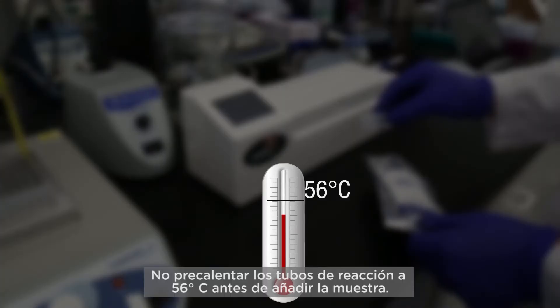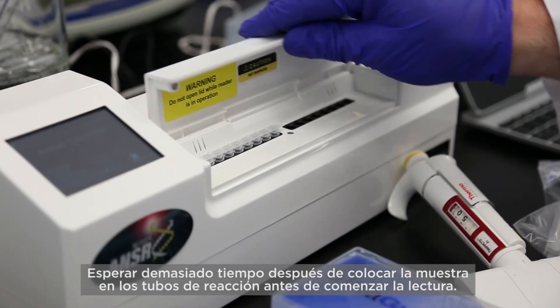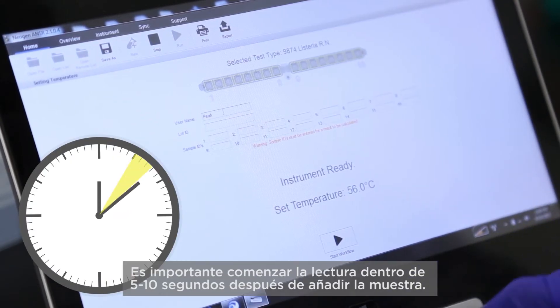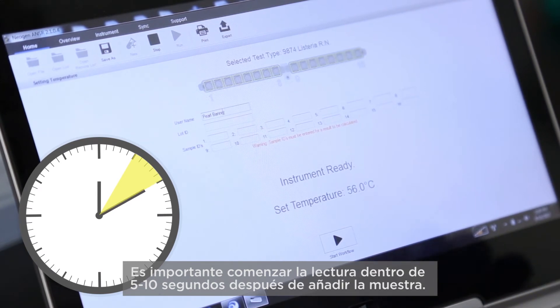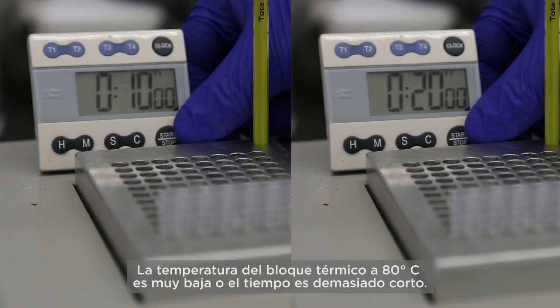Other causes of invalid results include failure to pre-warm the reaction tubes to 56 degrees prior to the addition of the sample, waiting too long after insertion of the sample into the reagent tubes before initiating the reading — it's important to begin the reading within 5 to 10 seconds after addition of the sample — and the temperature of the 80 degree heating block being too low or the time being too short.